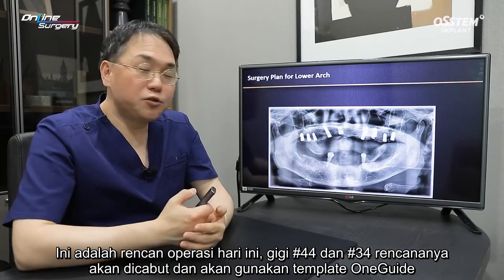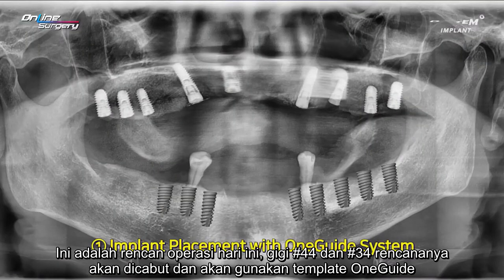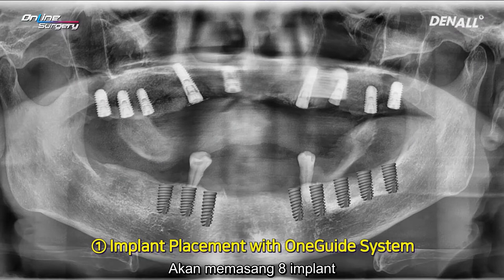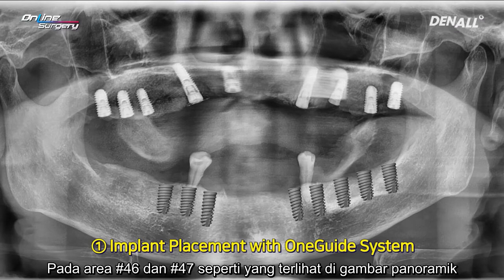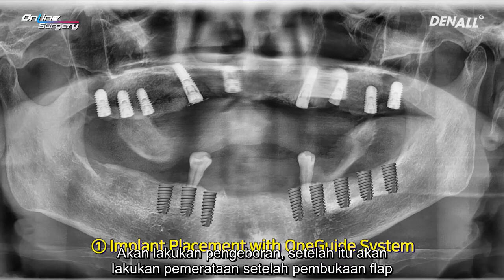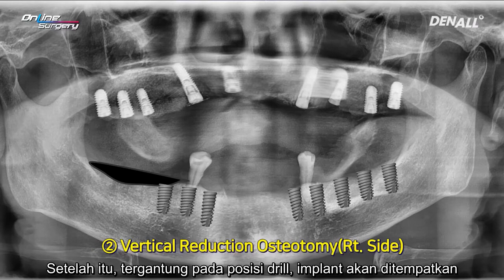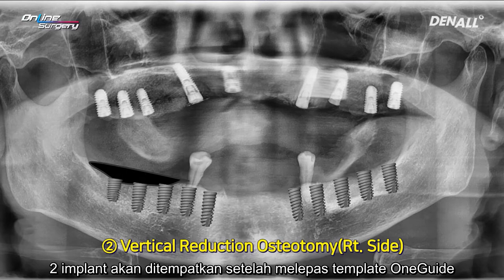Today, this is the surgical plan. Numbers 34 and 44 were planned for extraction. The OneGuide template is going to be used and fixed. 8 implants are going to be placed. At 46 and 47, as shown in the panoramic image, alveolar bone is extruded significantly. Drilling is going to be done, and then grinding is going to be done after reflecting the flap. After that, depending on the drill position, the implant is going to be placed. 2 implants are going to be placed after removing the OneGuide template.